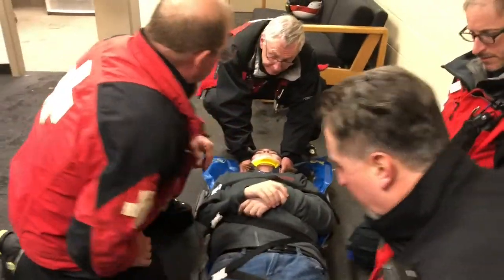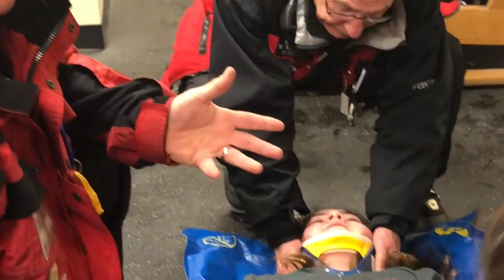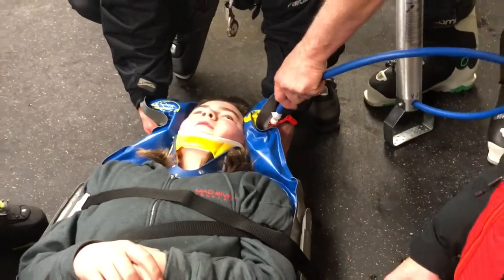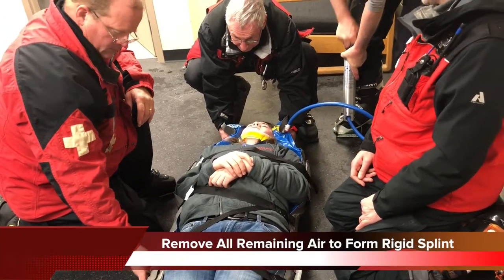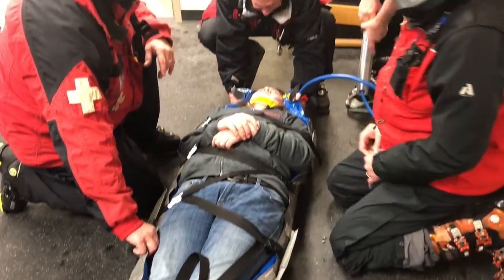Make sure the splint is secured snugly against the patient all the way up and down. Next, we're going to prepare the head — the vacuum splint will become my head immobilizer as well. Move it into position close to the head, rotate hands outside the splint, and take over holding it in place. We then remove all of the air from the splint. It will conform and become rigid, but it does not compress the patient — it forms around the patient without actually applying pressure. You can feel the splint become rigid once enough air has been removed.